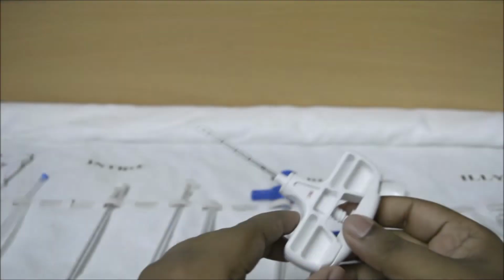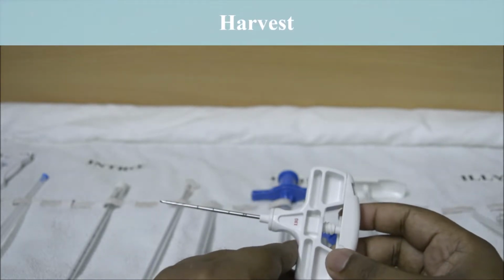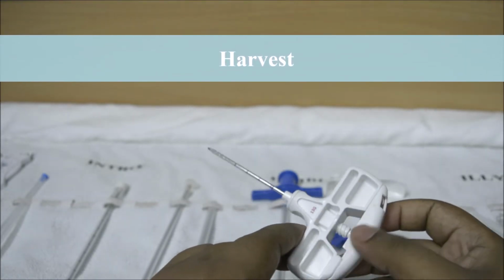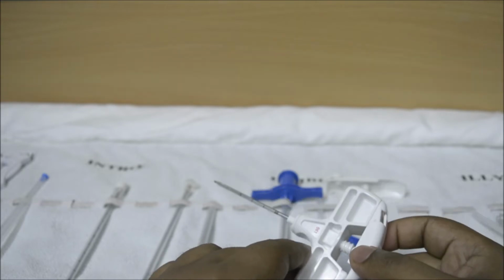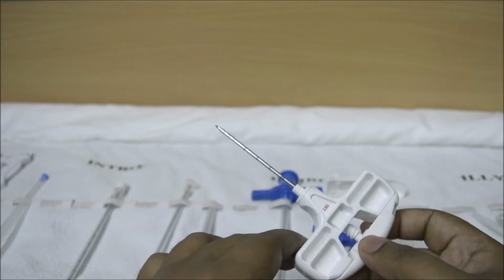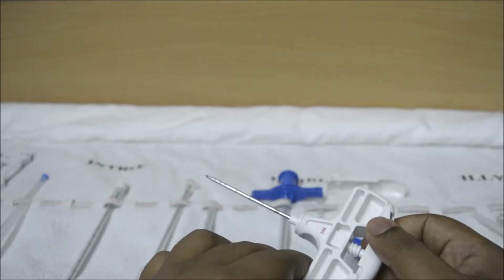The next needle we have is called the harvest needle. So what is a harvest needle? It is used for harvesting bone marrow. Bone marrow in the sense it is used for harvesting hematopoietic stem cells from the bone marrow.